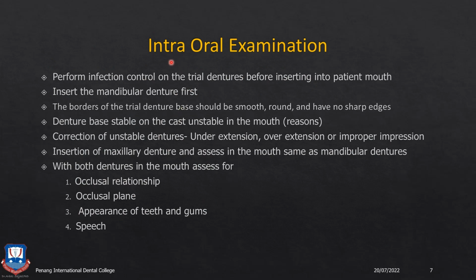Next, coming to the intraoral examination. First, you need to disinfect the dentures with a proper disinfectant like formaldehyde or glutaraldehyde for 10 minutes, or with spirit. You need to wash the dentures with soap and water before inserting them in the patient's mouth.